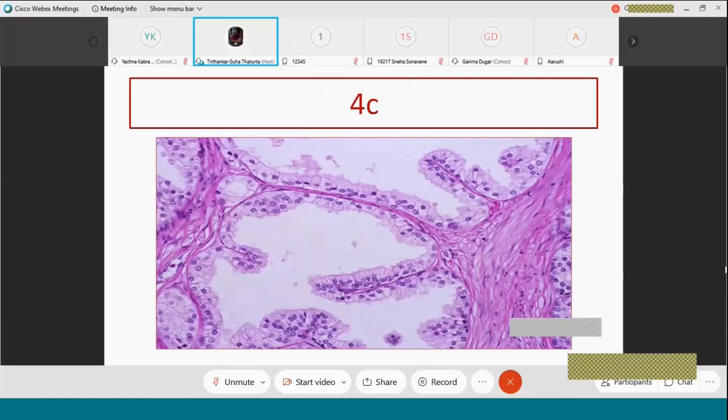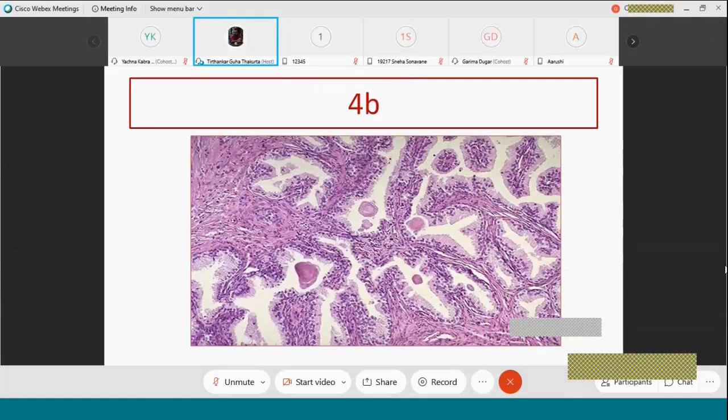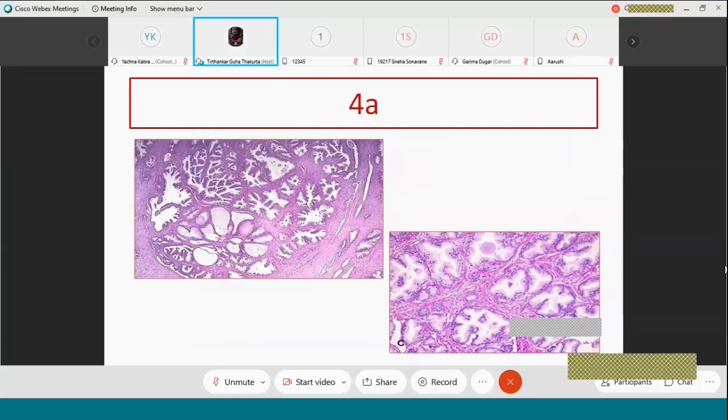Prostatic hyperplasia may not manifest very easily under the slide. The reason is, it will look like a normal prostate sometimes. But the size of the prostate was actually increased, because of which it was surgically removed. So it has to be seen grossly also, to see how the size has increased. Because both stroma and glands increase, so the ratio may not be changed.